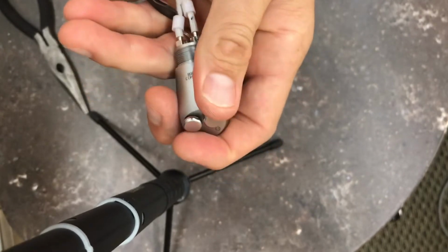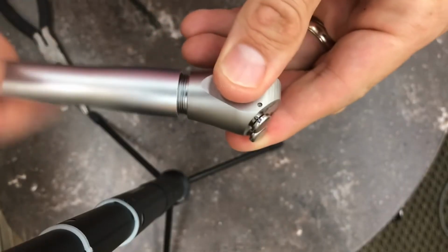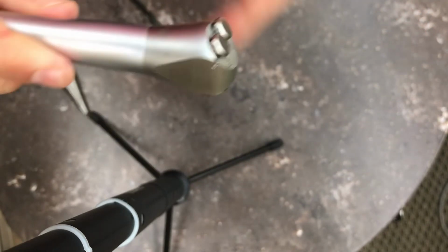Once the tubing is snug, go ahead and use that same flathead screwdriver, pushing the nylon collars up. Screw the air-water syringe handle back on, and you have completed the process of replacing your air-water syringe.